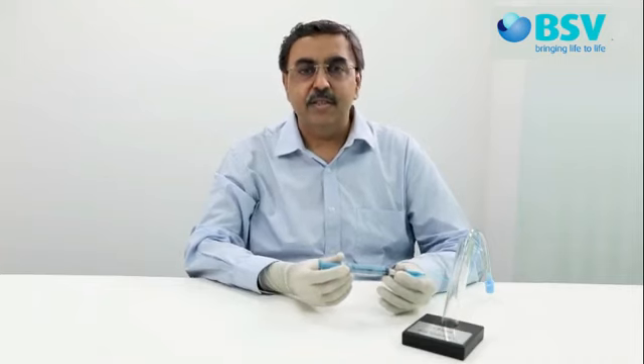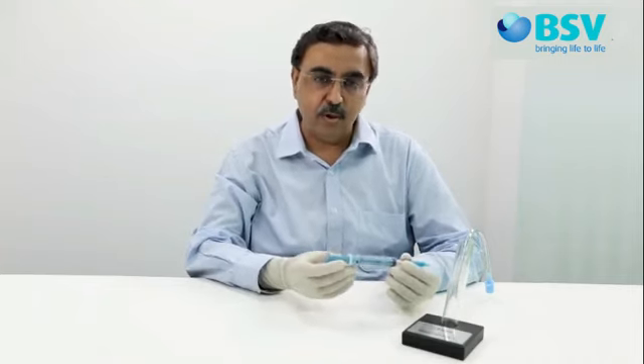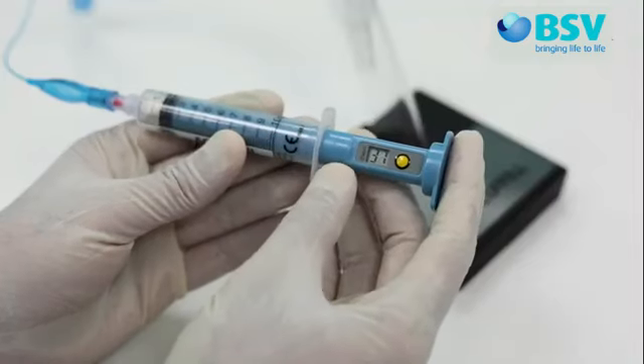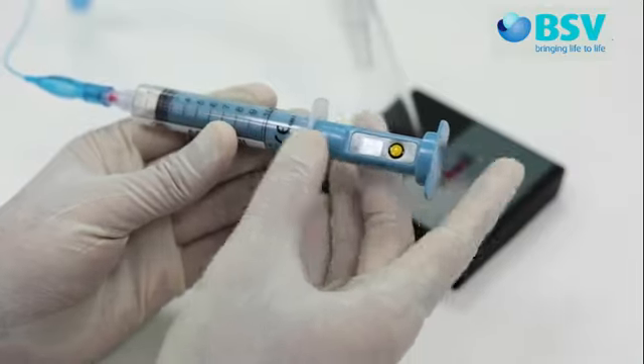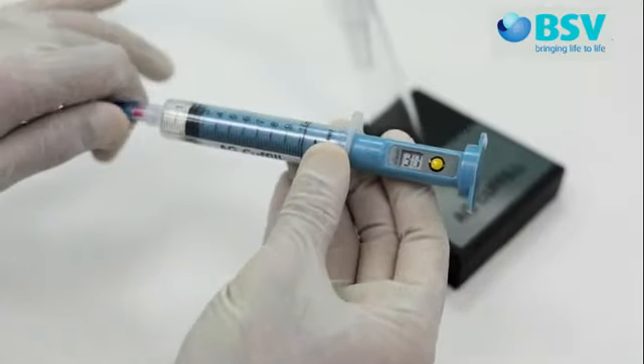In intubated patients, you may see fluctuations due to the ventilator mechanism. Consider the lower reading as the ET cuff pressure. If the ET cuff is overinflated, pull back the plunger slightly to adjust the pressure to the desired level and then disconnect.